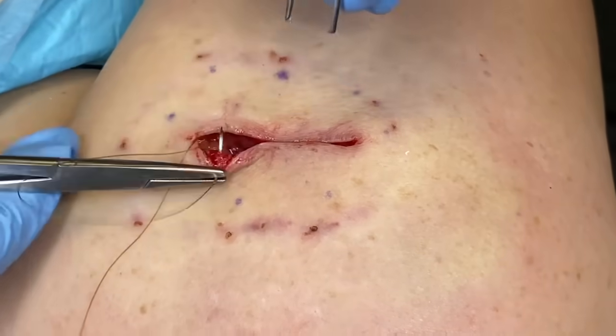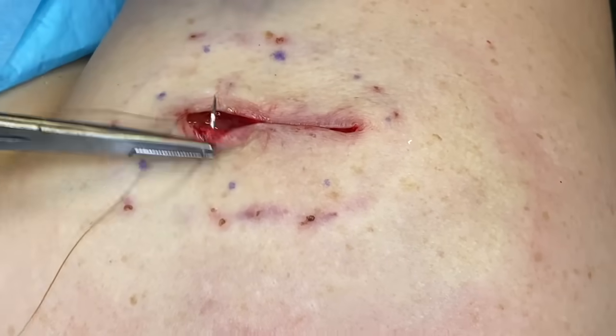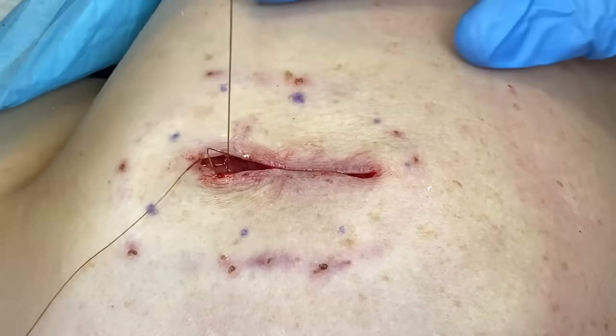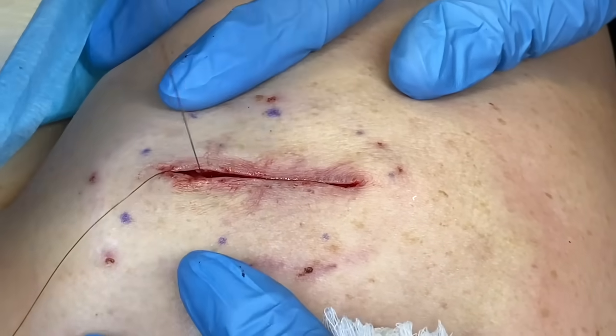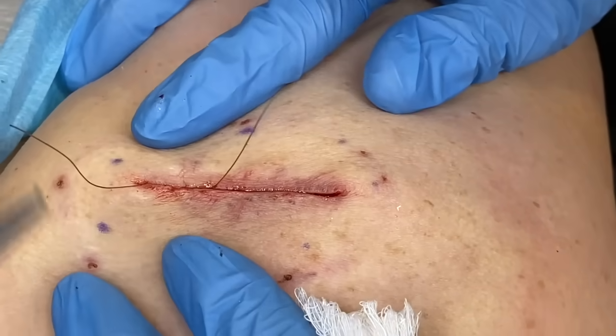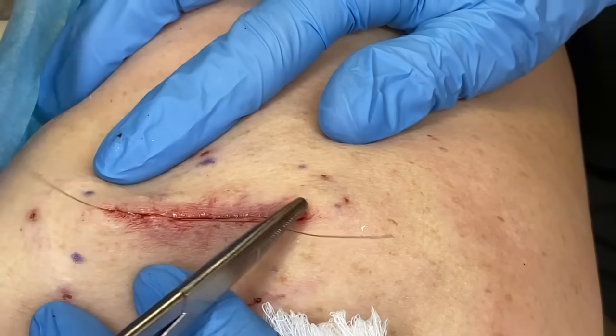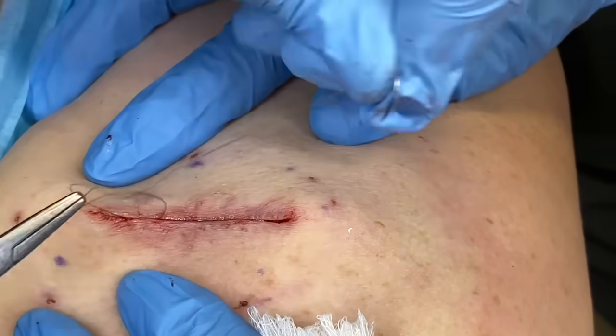But what you don't want to do is just close it quickly and put pressure on it. You can do that sometimes if it's a scalp, very superficial, because the pressure you put on will tamponade it. But if you're dealing with an actual deeper, bigger incision like this one, you'll get yourself into trouble. For sure you're going to have a hematoma, and those will complicate.